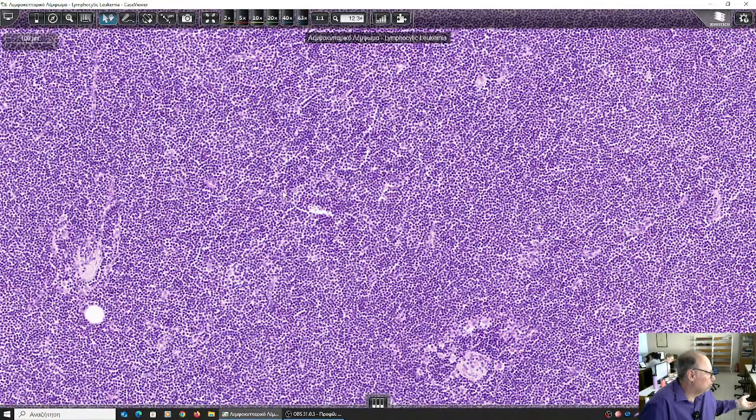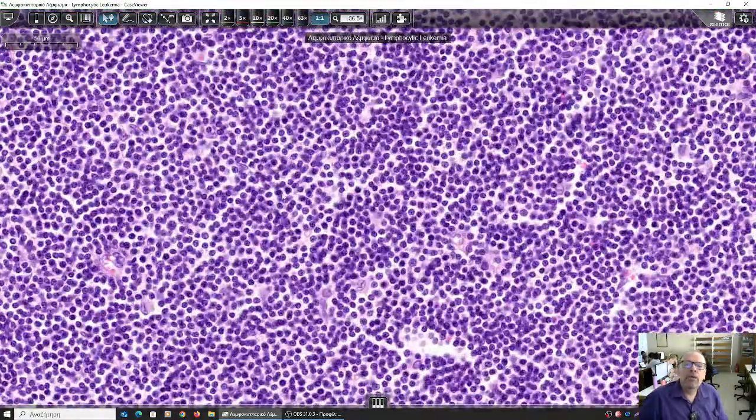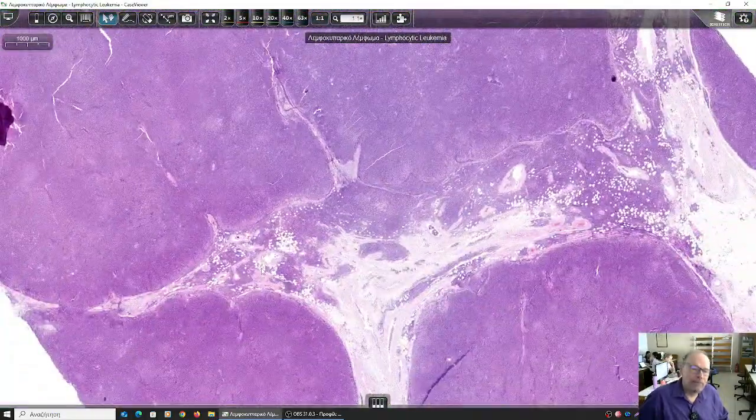It is not a Hodgkin lymphoma because malignant giant cells of Hodgkin lymphoma are absent, so it is probably a non-Hodgkin lymphoma, which we could not easily suspect as such because its cells are too mature. They are morphologically identical to normal lymphocytes. However, this monotony is not compatible with a normal lymph node.